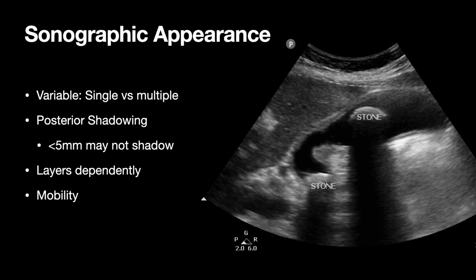And so the way I generally look at this one is if you have right upper quadrant pain, you see gallstones, you're probably operating in the right territory saying that this gallbladder is causing that pain. However, the stones that are moving around are not the ones that are actively causing the patient's pain, right? Because they're not obstructed. There's probably one that you're missing somewhere in the ductal system that's actually causing this patient's pain.